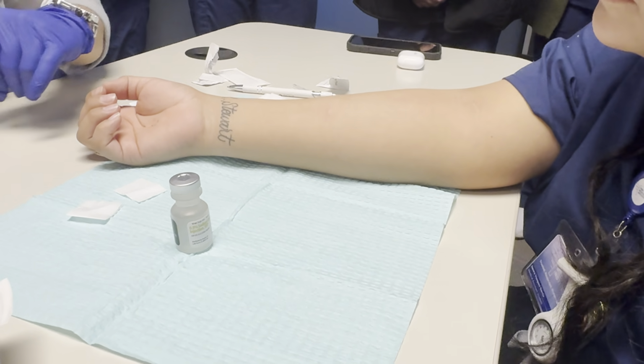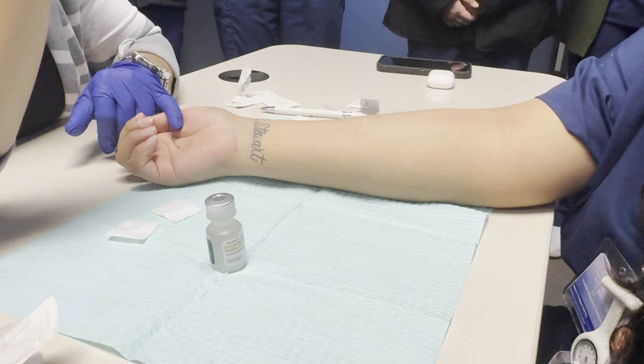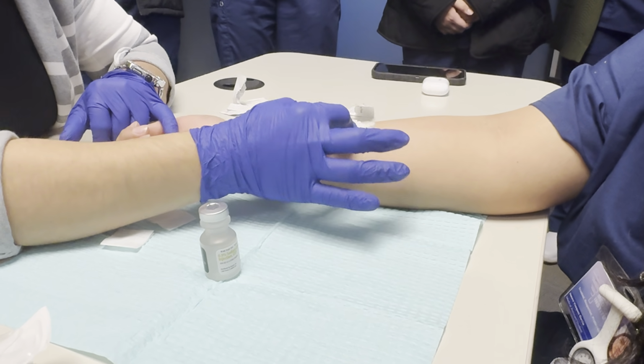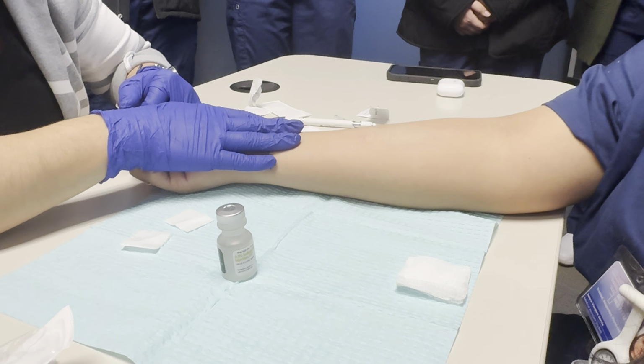Now from here on, if there's any leaking, we're just going to grab a gauze. No alcohol wipe, no bandages. Gently dab, dab, dab. Okay? So this is the post instruction to my patient.